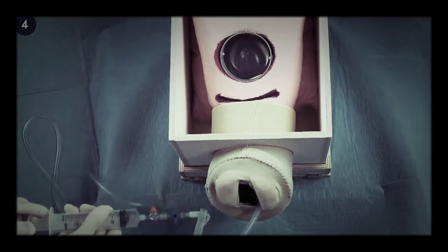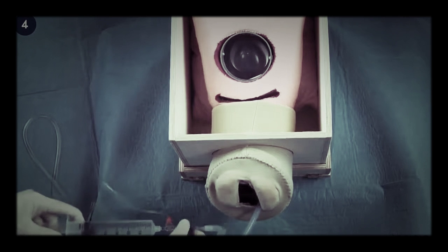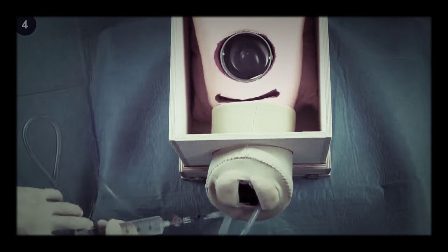Care should be taken to fill the balloon with no more than 500 millilitres of saline. Overinflation may result in the balloon being displaced into the vagina.